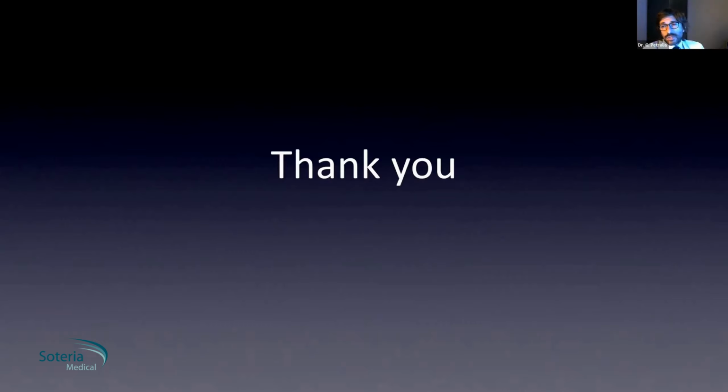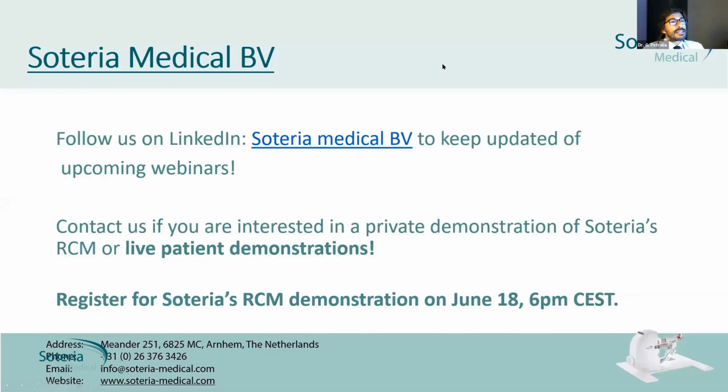Yes, of course. But still, you see, our overall upgrade was 30%, which is exactly in keeping with the literature. I wanted to highlight this because I think we have to address scientifically this point, the 3+3, because we probably don't see small foci of Gleason 4 with MRI, and therefore we cannot put a needle there. But at the final histology on the whole-mount section they are still seen. So what is the relevance of that? I do not know. But it's something which stimulates our brain to do further research.